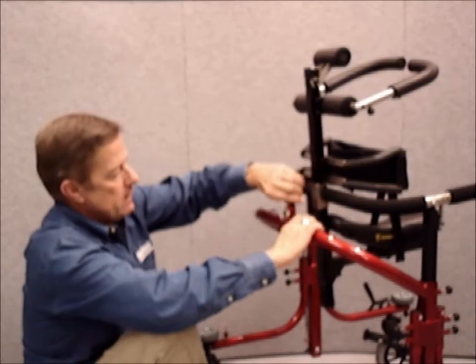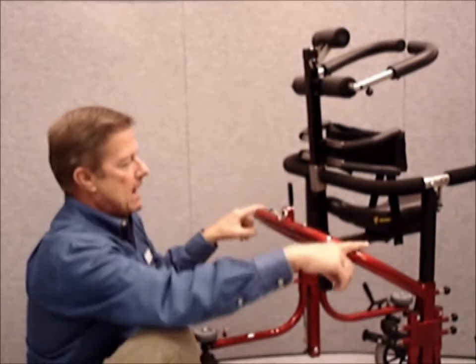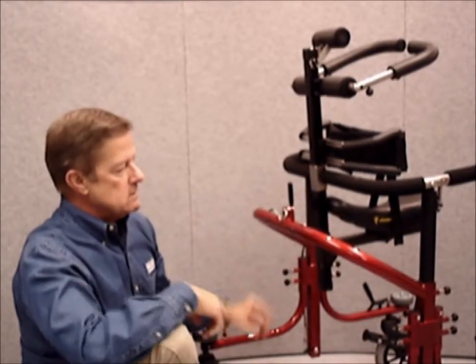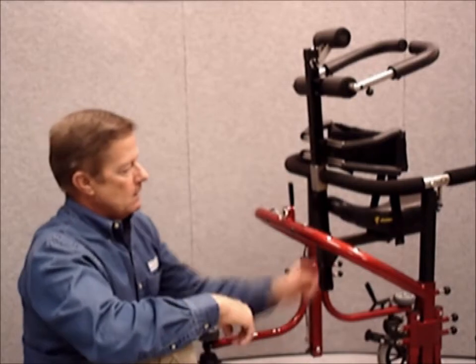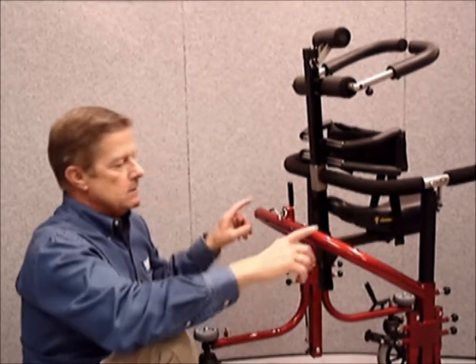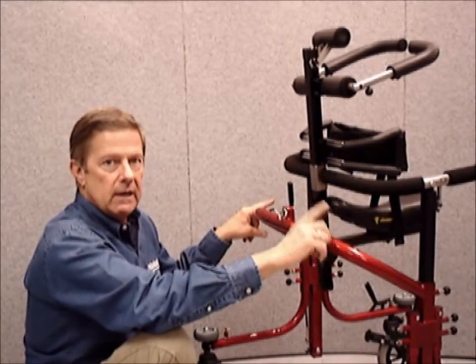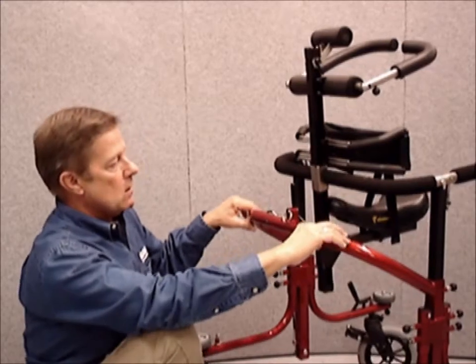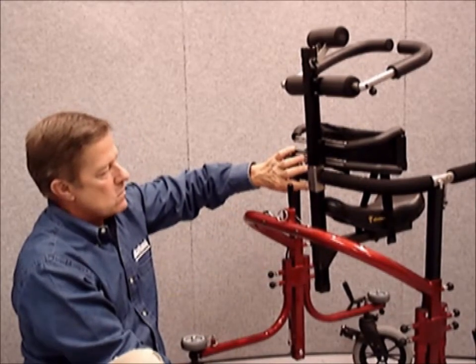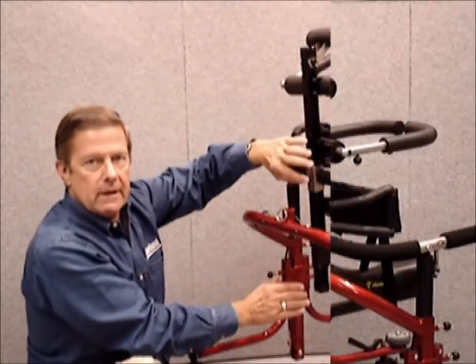Actuate the gas spring up. The gas spring has a rise of 7.9 inches. Your user's inseam should be somewhere in between the seat height to the floor and the 7.9 rise in the gas actuated spring. If that is not correct, you can adjust by loosening the 2 screws on the vertical column and shift the vertical column either up or down to your desired height.